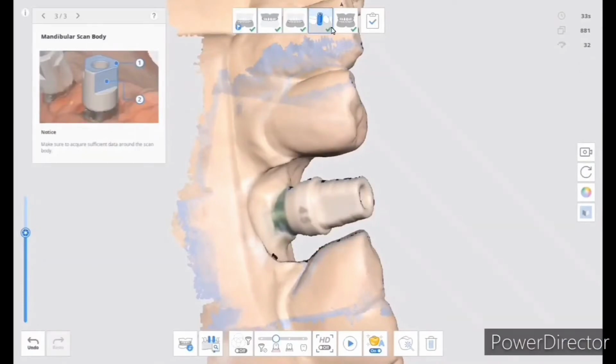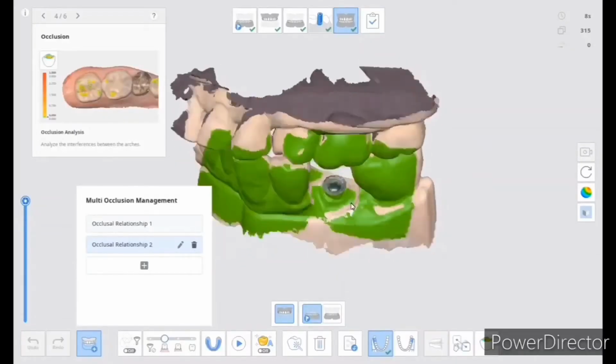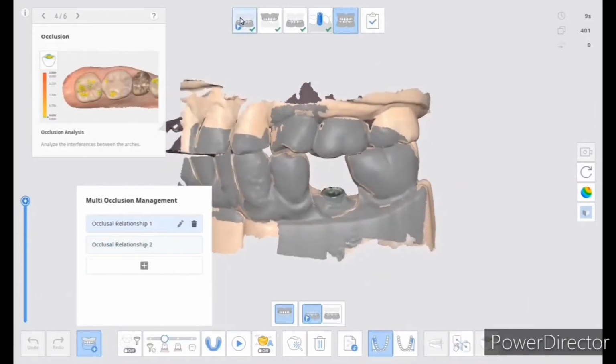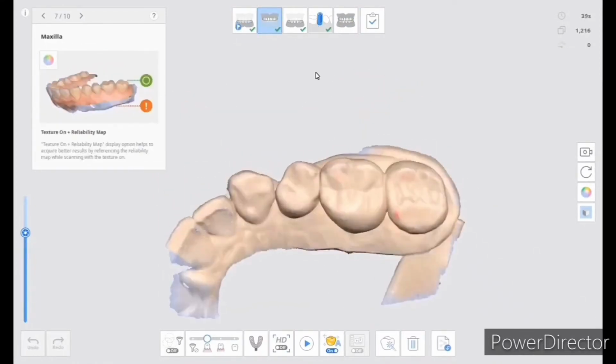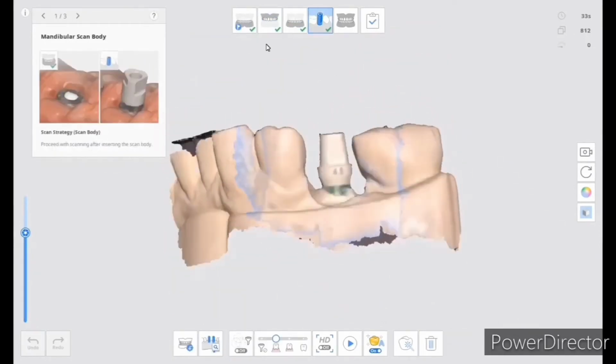Second, the environment in the mouth is relatively dark, and the light intensity of the LED light source is insufficient, resulting in the need for a large aperture of the camera lens. We all know that the larger the aperture, the smaller the depth of field, so the depth of field of 3D structured light is often only about 12 to 15 millimeters.